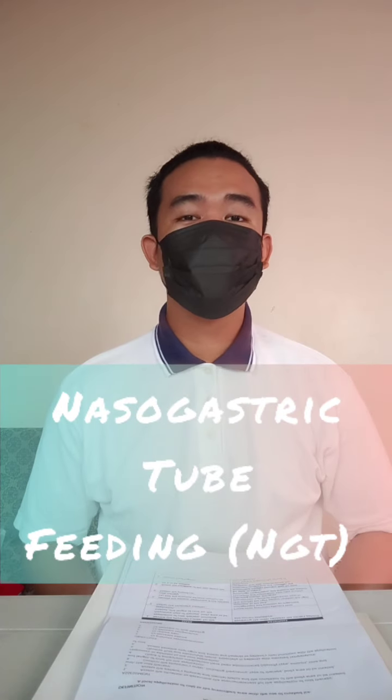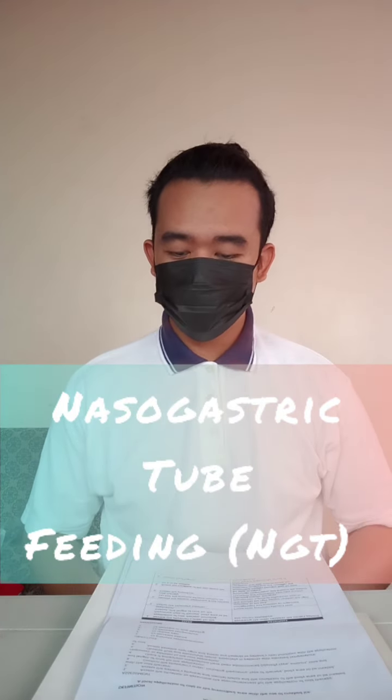From BSN2 Mercer, and today I am going to do the procedure called nasogastric tube feeding or NGT. So the definition: nasogastric tube feeding is the instillation of specially prepared nutrients into the stomach through a nasogastric tube.